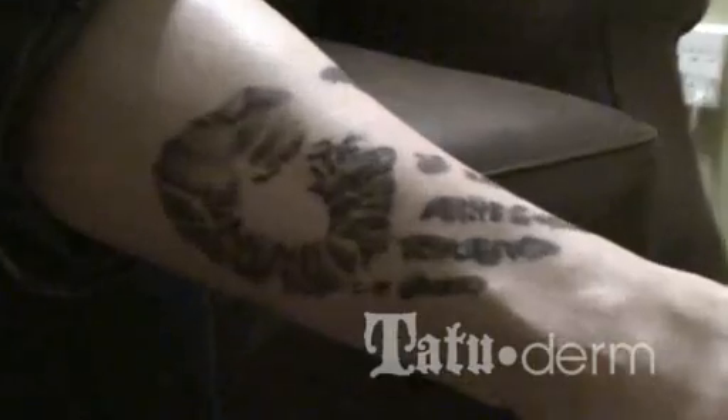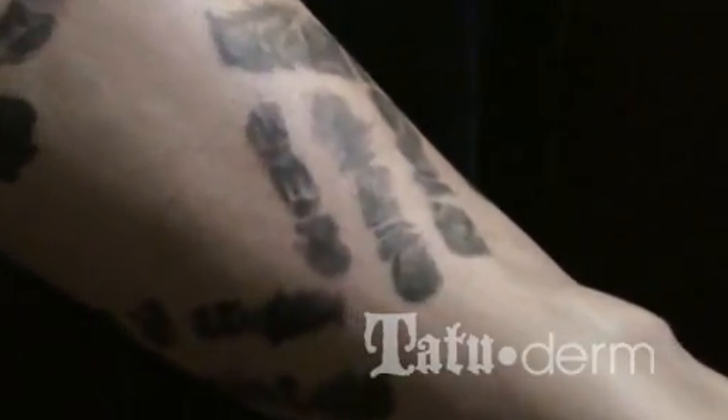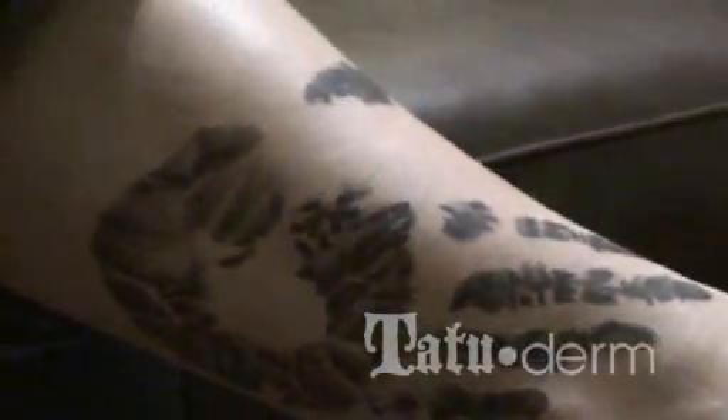This is Shannon's leg after five days of Tattoo Derm. She did very well — no weeping and didn't even need a re-bandage. As you can see, there's zero scab. It is absolutely immaculate, with really no traces that it's even a new tattoo besides the fact that we know when it was put on.